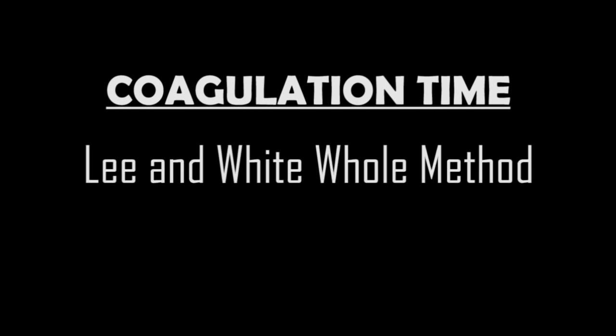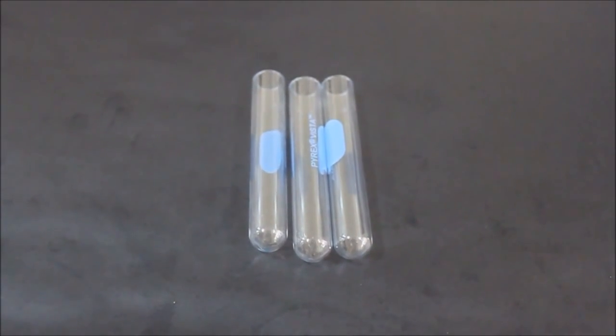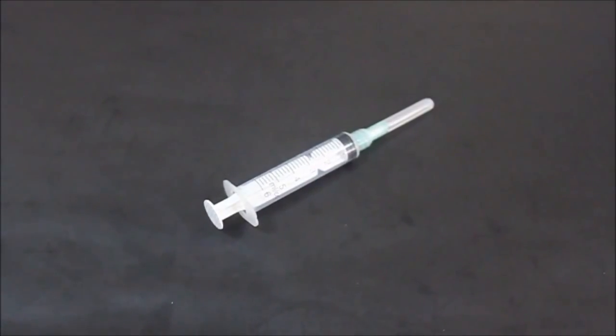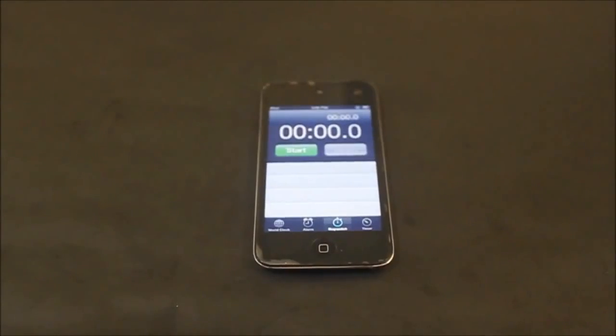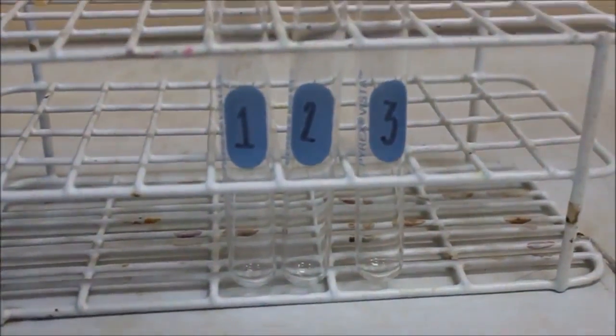Coagulation time is the time required for whole blood to clot. Some materials needed for the Lee and White whole blood method are three 5 ml glass test tubes, disposable syringe with needle, timer, and water bath. First, prepare 3 clean test tubes and label each as test tube 1, 2, and 3.